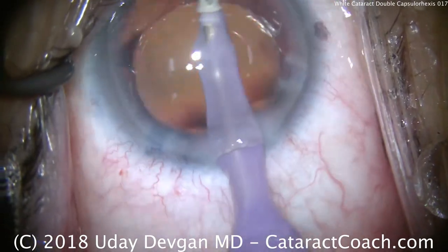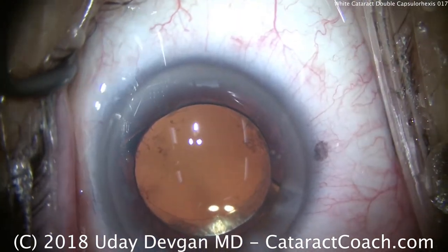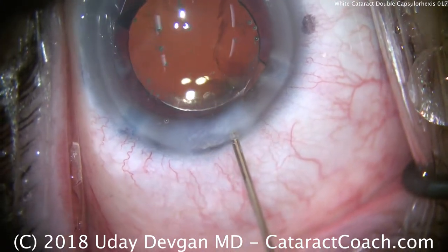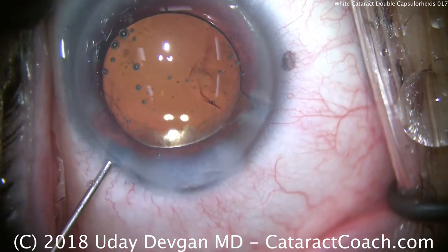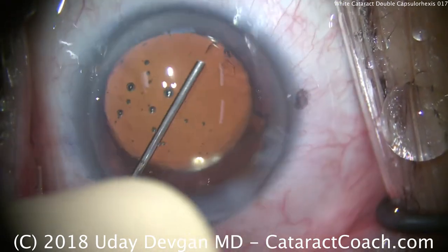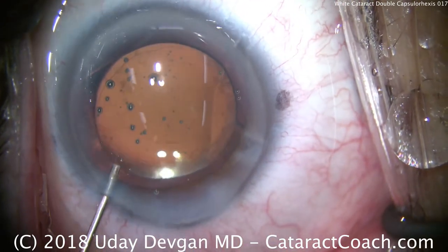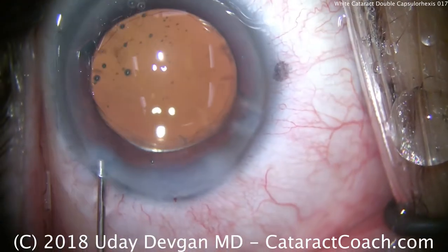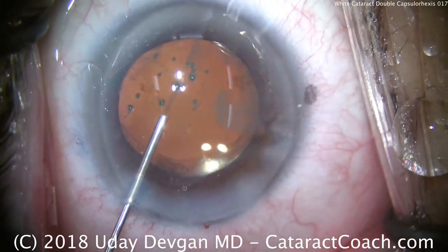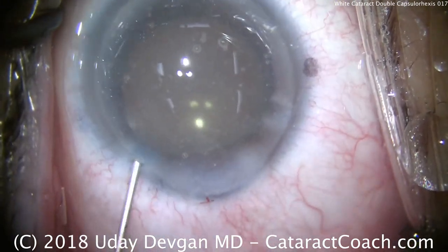Now, this 6mm lens does look big in this eye. In fact, this patient is hyperopic, and that's why the lens appears to be on the larger side. I'm going to do some hydration of the main incision to seal that up. Through the paracentesis, I'll first irrigate out the angle of the eye to get out any residual viscoelastic or perhaps any lens pieces that are remaining. I do like to remove the viscoelastic from behind the lens — I find that it makes for a quicker post-op recovery of good vision and helps avoid post-operative IOP spikes. These patients may also have a little more inflammation post-op, so I'm going to put some triamcinolone in the anterior chamber to help deal with the post-operative inflammation. That looks great — thank you guys for watching.